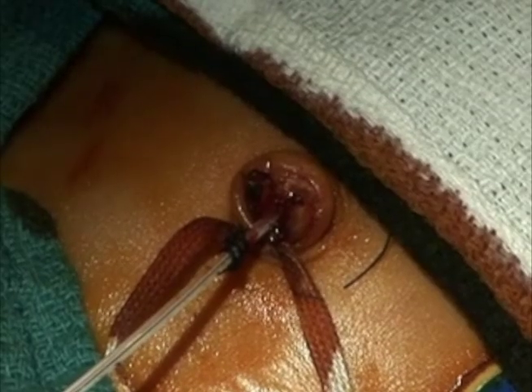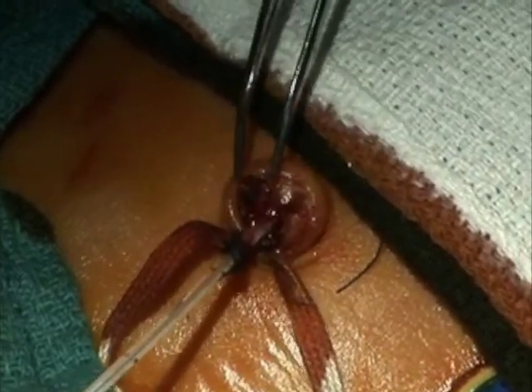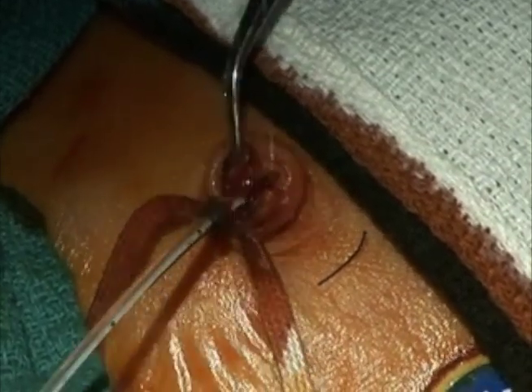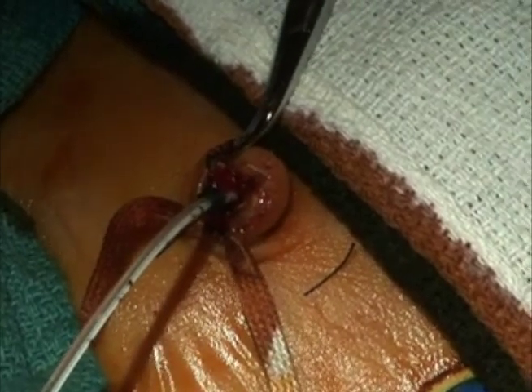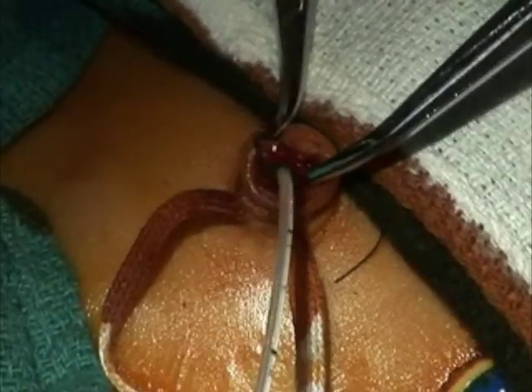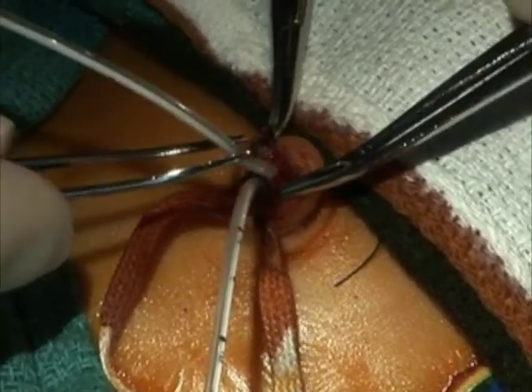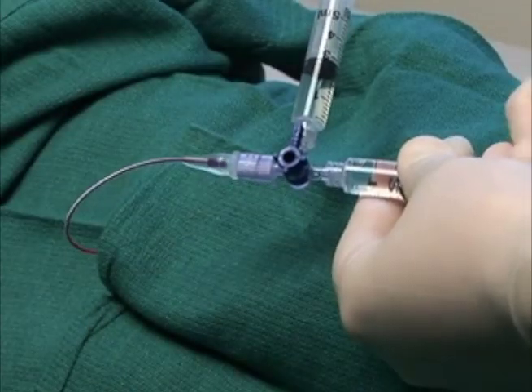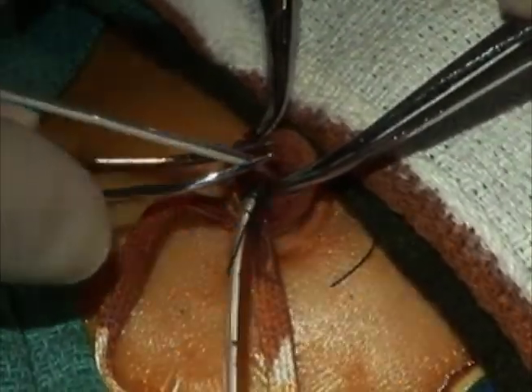To insert an umbilical vein catheter, with your non-dominant hand, grasp the cord with the toothed forceps. With your dominant hand, using the mosquito forceps, remove any blood clots from the entrance of the vein. Using the mosquito forceps, introduce the pre-flushed venous catheter attached to the stopcock and syringe into the lumen of the vein and insert 3 centimeters. Gently pull back on the syringe to ensure blood return and proper placement. If blood returns, continue inserting the catheter to the predetermined depth.